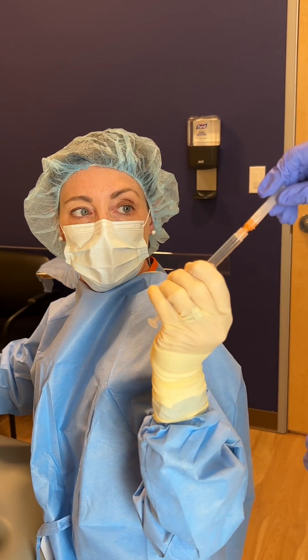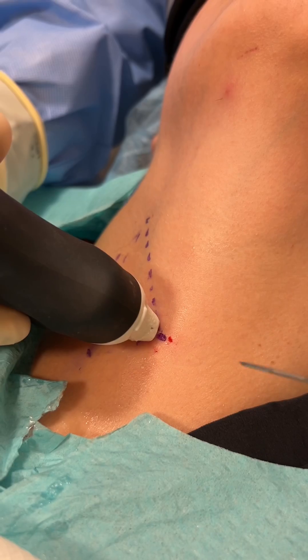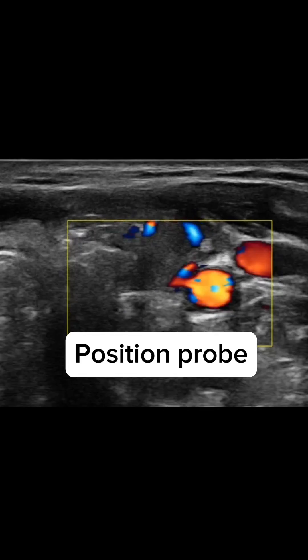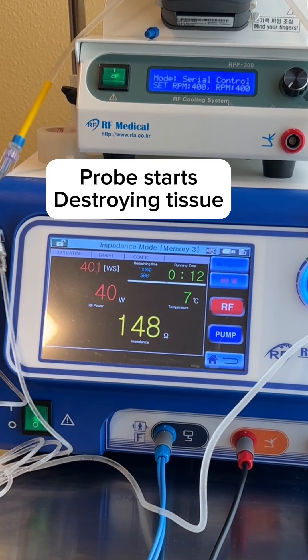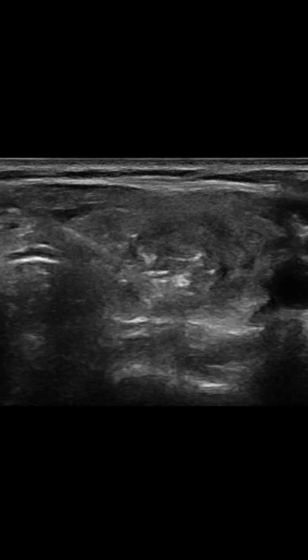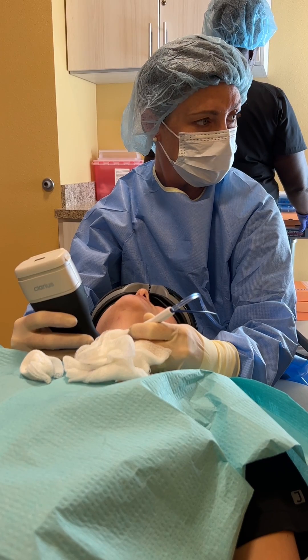Three CC's lido. Probe. Probe on. Probe off. Do you feel anything? Any sharp? No.